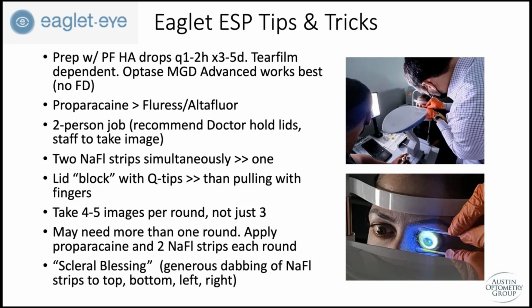Soft lenses usually only need a day or 2, but for scleral lenses it's really best to give them several days. You're going to numb the eye. I think that regular proparacaine just works better than using some kind of combination drop like Altafluor. These are 2-person jobs. You're really going to want somebody driving the instrument, and then another person holding the lids. My recommendation is have the doctor hold the lids.